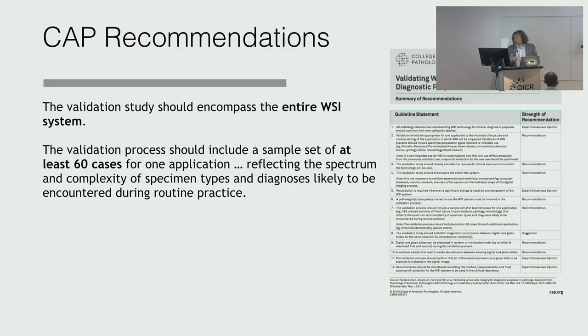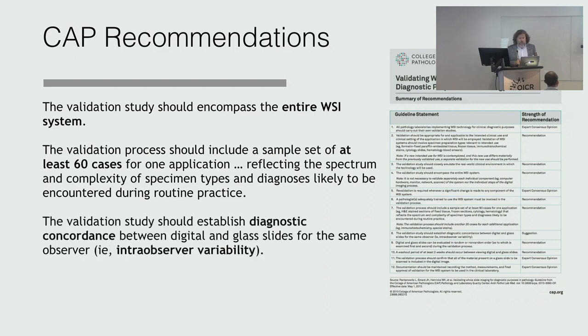The CAP is suggesting that if you want to see whether digital is the same as microscopy, you have to look at least at 60 patients. They should be representative, in terms of complexity and so on. And you have to look at the diagnostic concordance.